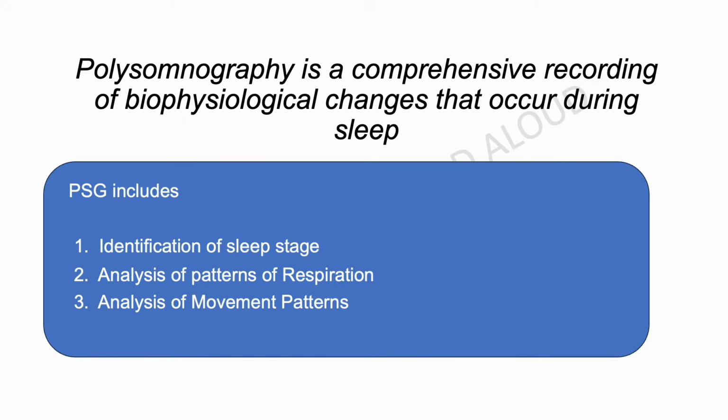So basically, when we are reading a sleep study report, one has to remember that it is actually a recording where we are trying to understand the biophysiological changes which are occurring during sleep.